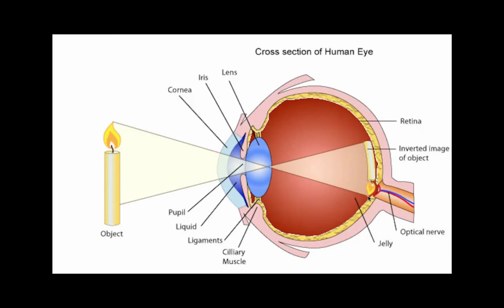How does our retina receive that light? Well, as you can see from this diagram, light is refracted in the cornea right here. However, for some people, light is not refracted correctly, also known as a refractive error, which causes these eye problems. LASIK allows the eye to be altered in order to solve these refractive errors.